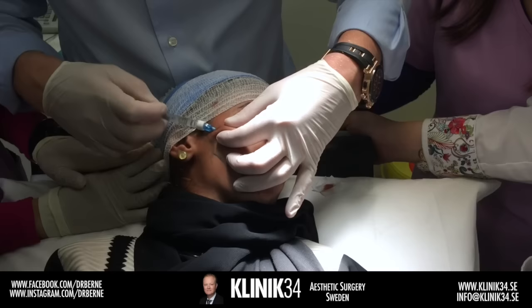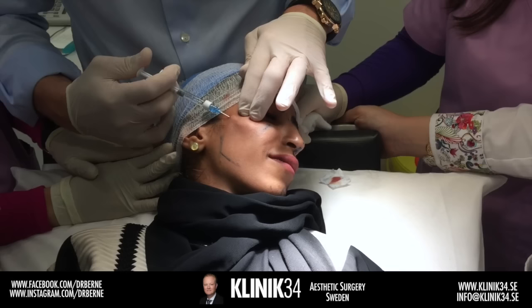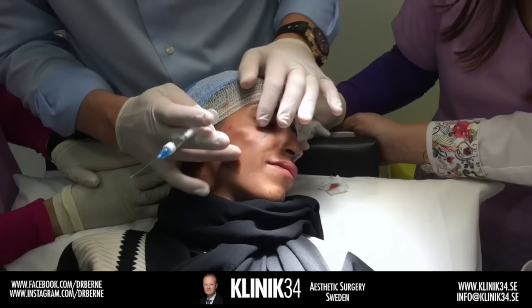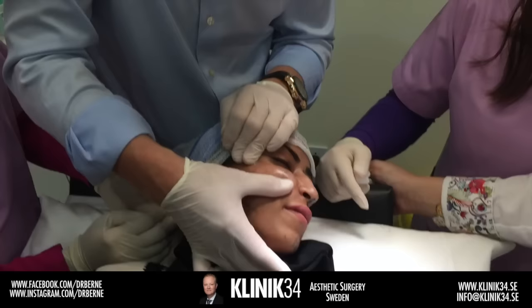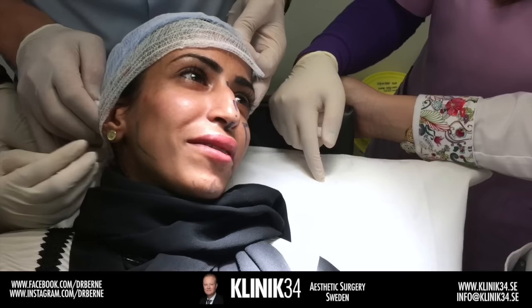So once again, lift it up. This is Perlinе — you can see that, but it still doesn't move. We need to create a smooth mid face. The 1.5ml made a lot of difference for her. My suggestion is we treat this side and then do the other.